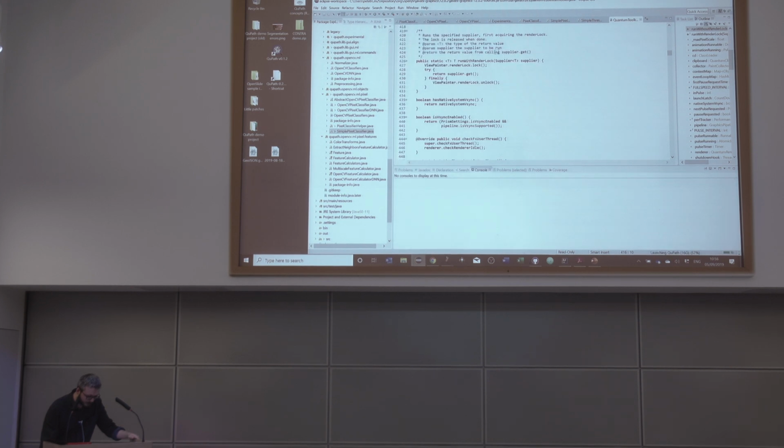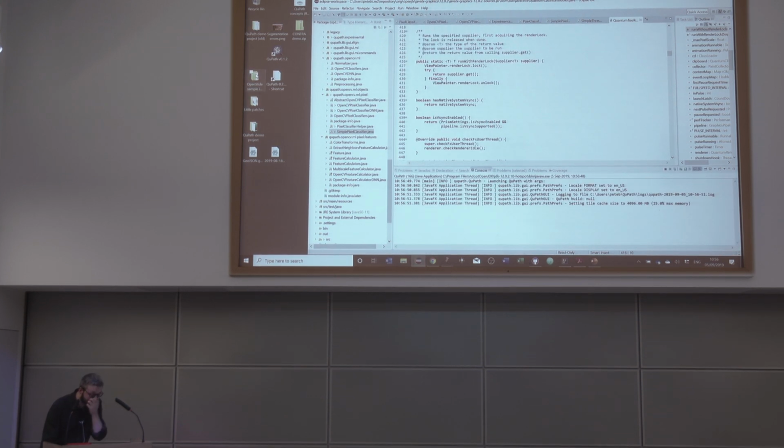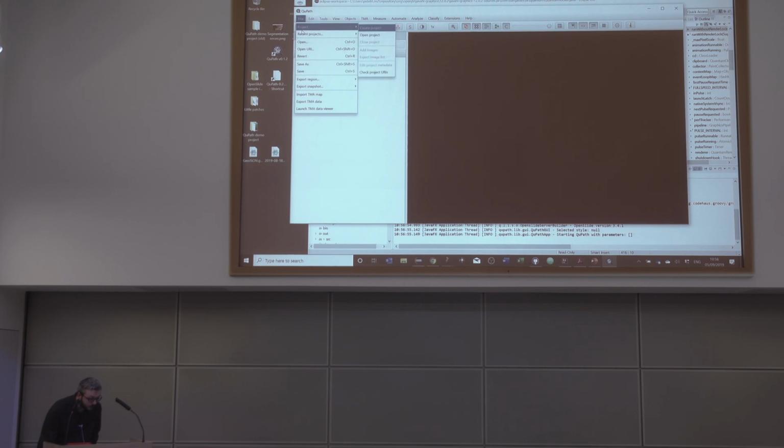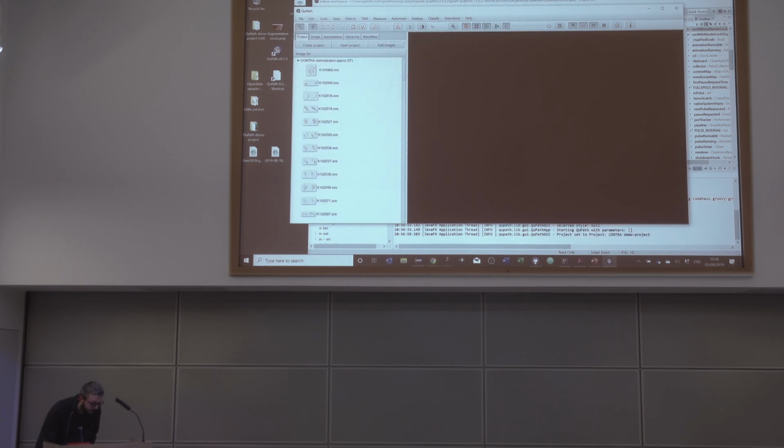Just two very quick questions. I didn't quite catch which deep learning framework you were saying you were using, because obviously you managed to get this working in some way.